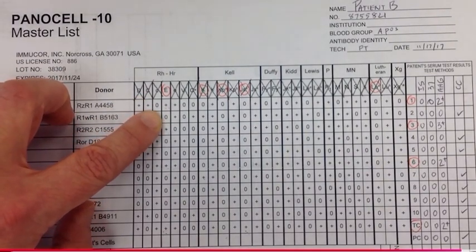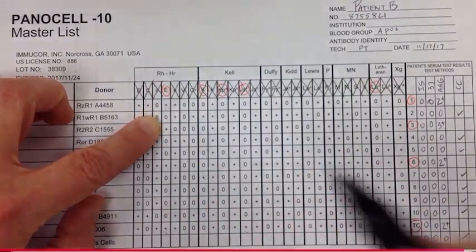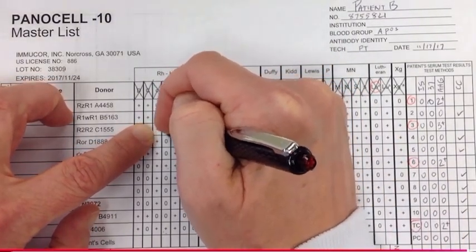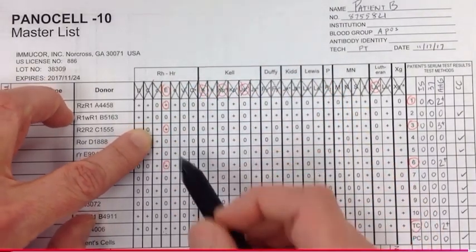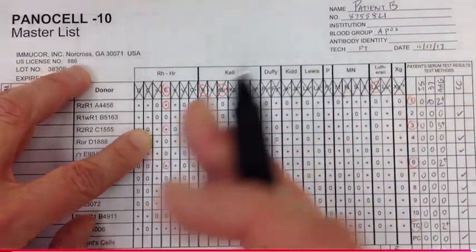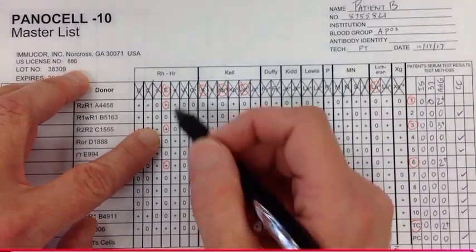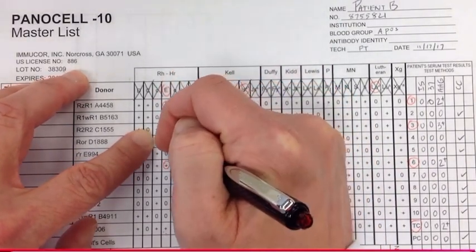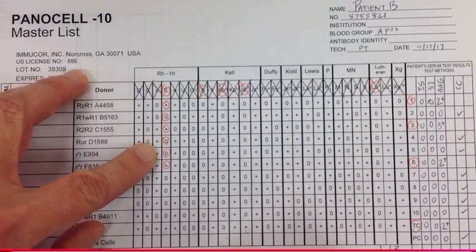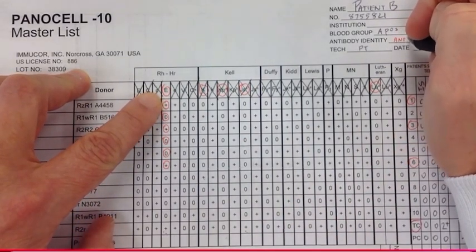So now we have to fulfill the rule of three. And the rule of three states that for any antibody, it has to be positive in 3 cells and negative in 3 cells. So we have 1, 2, 3, and there are no other antibodies taken into consideration here, meaning that we're not really worrying about more than one antibody being present. We've pretty much ruled everything else out. And then we have -1, -2, -3. So our rule of three has been met. So we can say with confidence that the antibody we're dealing with here is anti-E.